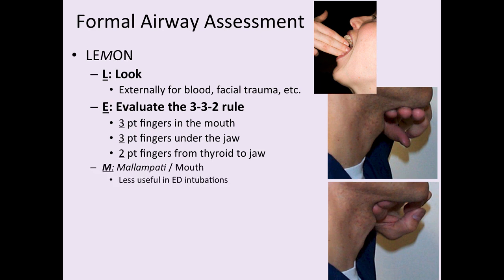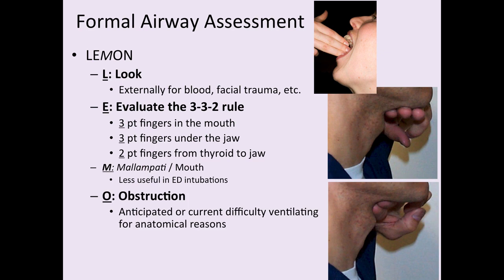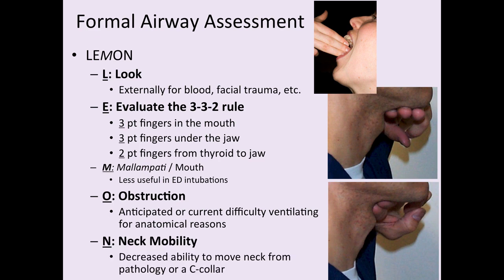And the Mallampati, it has some usefulness, but the patients are usually flat on their back in the ED, so a little less useful for us downstairs. And then obstruction, right? If you're having difficulty ventilating the patient because of an obstruction, you're going to have difficulty intubating the patient. And then difficulty moving the neck can make things a little bit more difficult, or a lot more difficult.